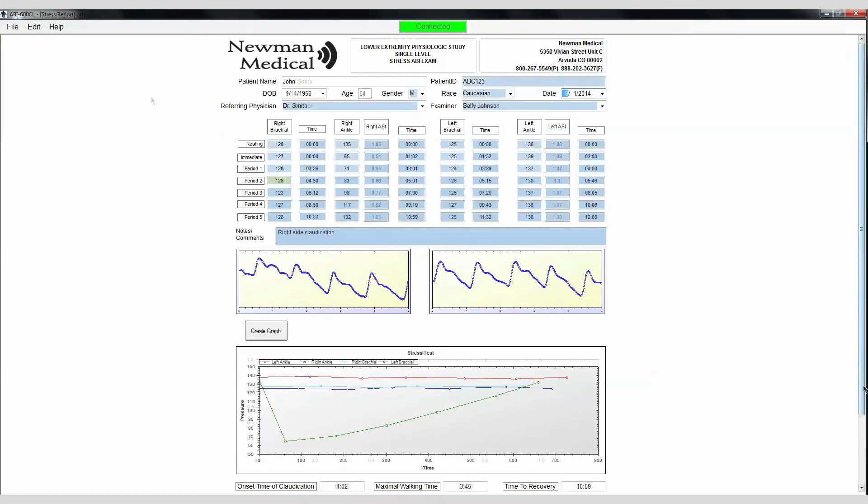A graph of pressures versus time can be created by clicking on the Create Graph box on the report. In the Notes comments section of the report, make a note of the time of onset of claudication or other symptoms, maximal walking time, and time to recovery.